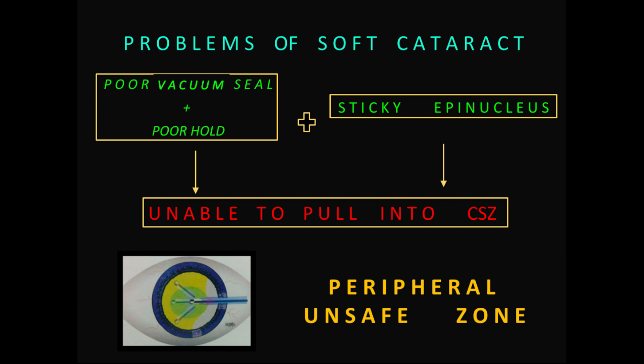Coming to the problems with soft cataract and how to overcome them. The two problems are: number one, no good vacuum seal or hold on the nucleus; and number two, a sticky epinucleus that does not allow you to pull the nucleus into the central safe zone. In soft cataract, as soon as you nudge the nucleus and try to create a vacuum seal, being soft it gets sucked in — and if you lower the vacuum too much, the hold is poor.